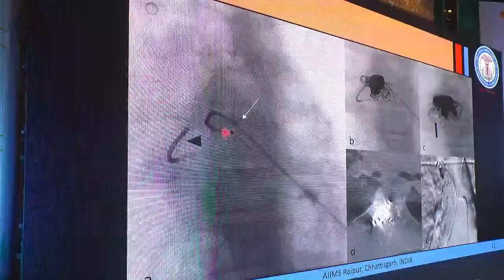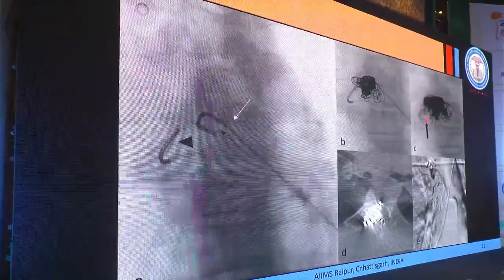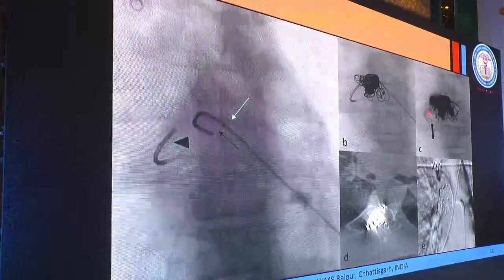And through that cannula, we took the microcatheter within that sac, and through that microcatheter, we put some coils within the sac, and then we injected glue within the sac. So this is the glue cast which we are seeing, and retrograde filling of the various feeders which are also seen. And this is the expert CT image, the axial section where we are seeing the coil and the glue cast, and this is the post embolization angio run where we are seeing that there is no fistula from the right D7 level.